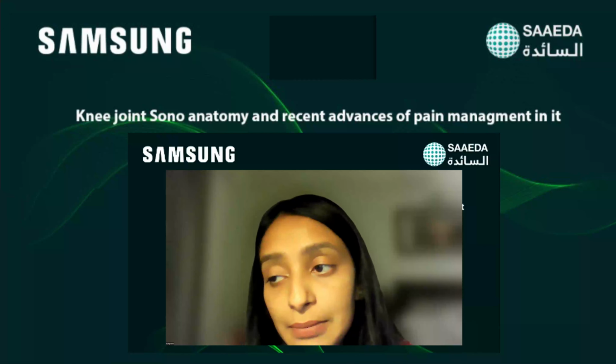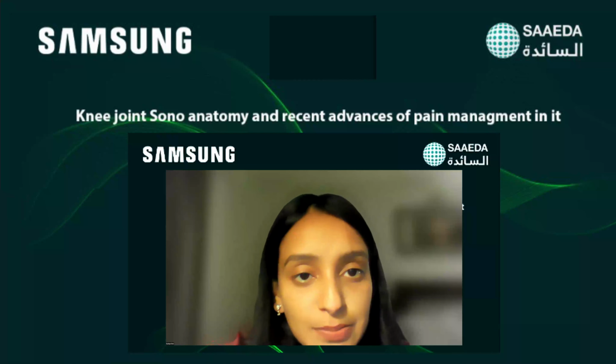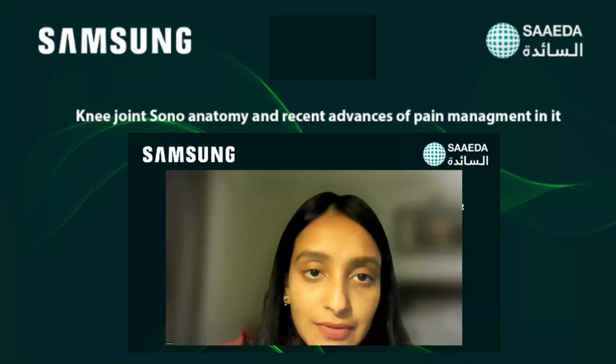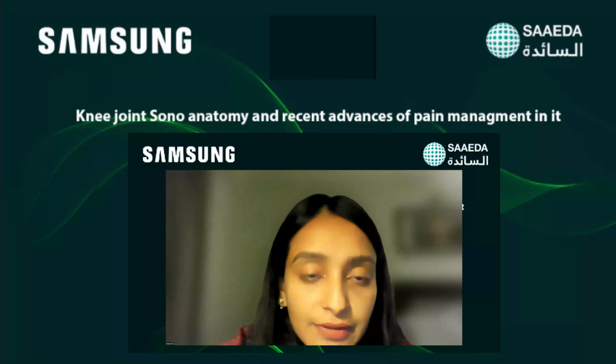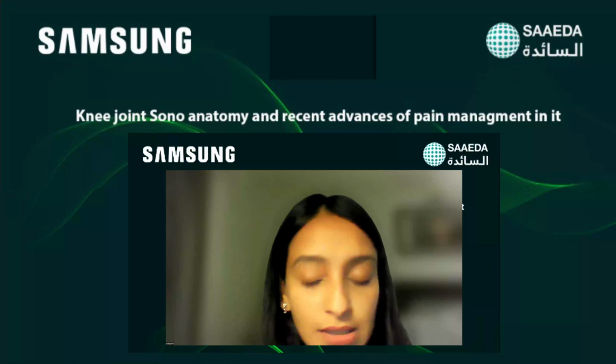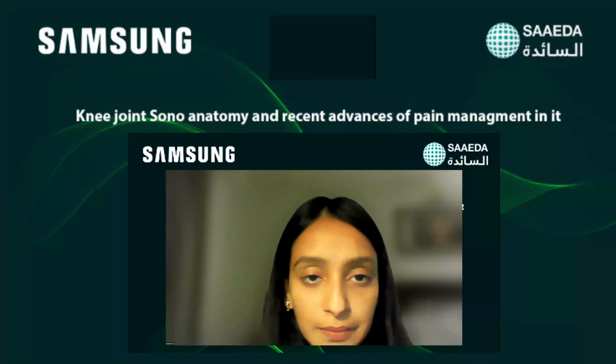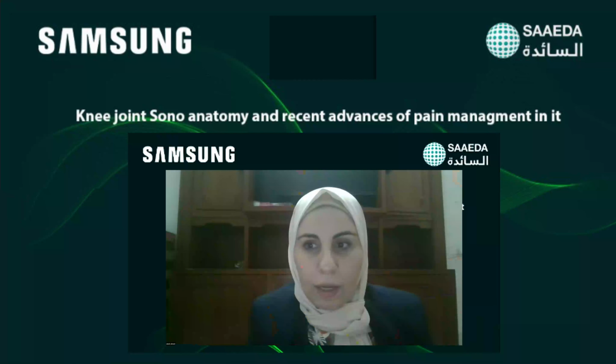So pulsed can be used only where there is mixed nerve supply. It gives better results in those cases where we want to preserve the nerve. Otherwise, it's better to go for conventional. And if we get cooled radiofrequency or cryo, that is very good, mainly because of the size of the lesion.